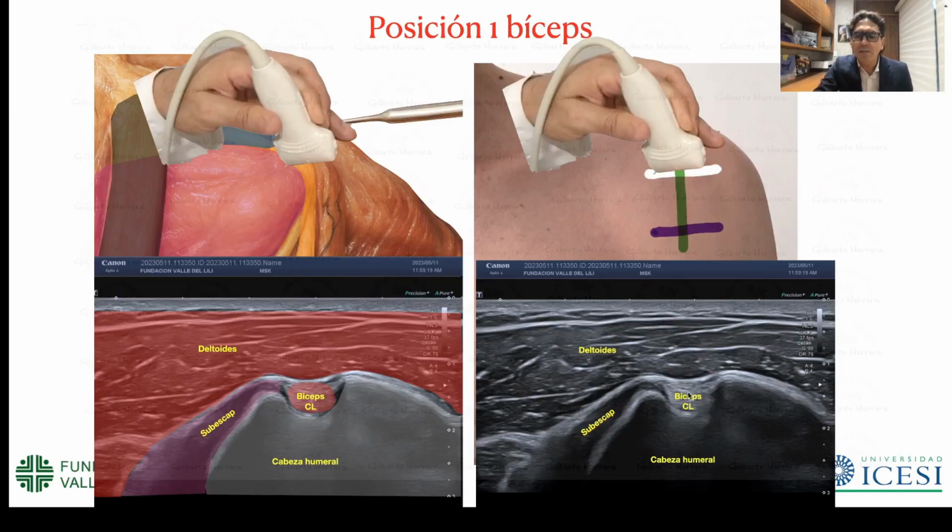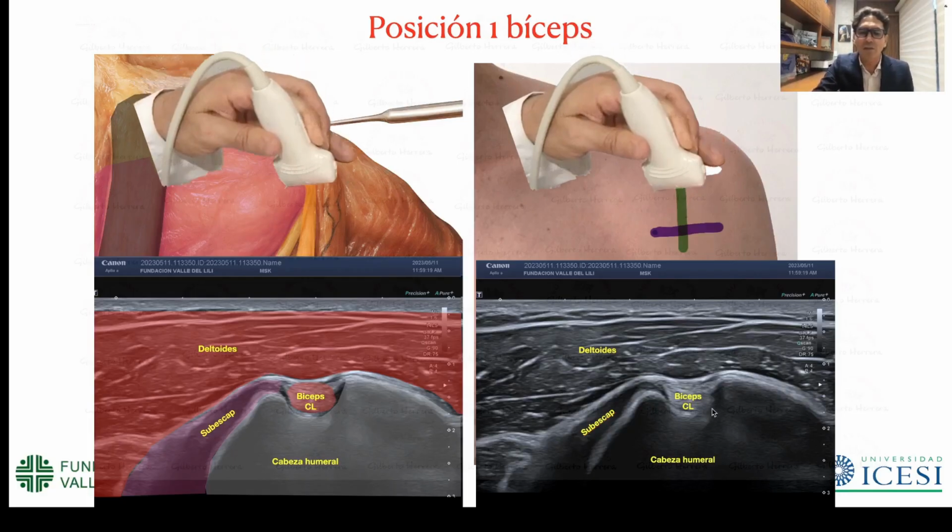So a tendon that gives us a salt and pepper appearance is a tendon. It has a lot of anisotropy, which is why we see it as hyperechoic, very bright within a bony structure that we also already know how to identify by its posterior acoustic shadow. Here, we basically evaluate the bone cortices, the patterns, which are what we use to identify each of the muscles, also already recognizable by each of us. So what is the segment to study? In this case, the key to studying this area is the biceps, which we can see with its distinct characteristics.